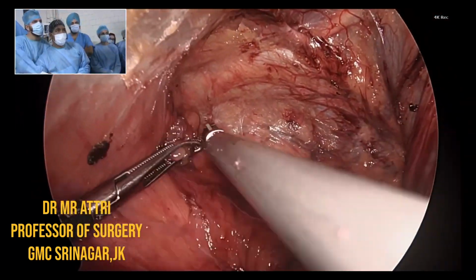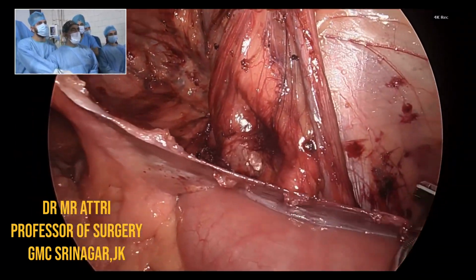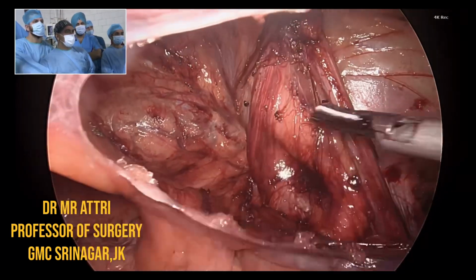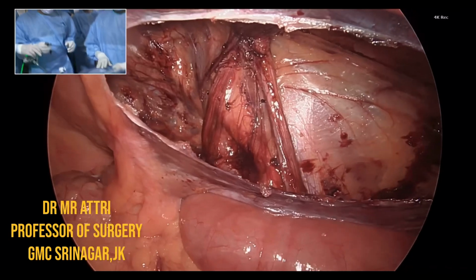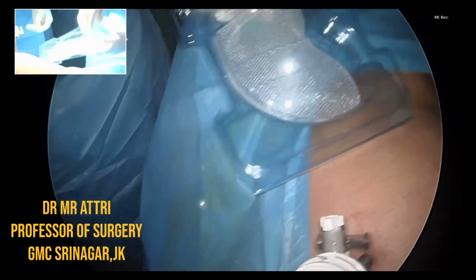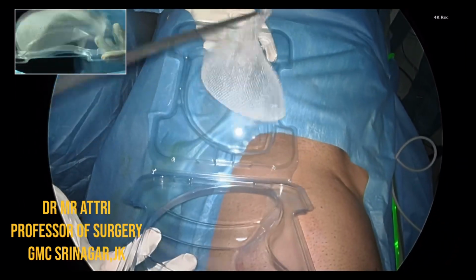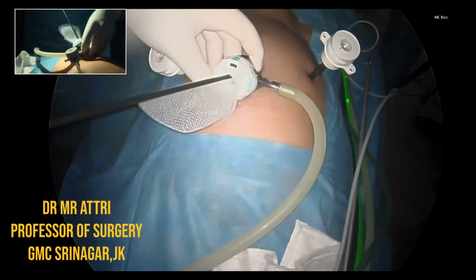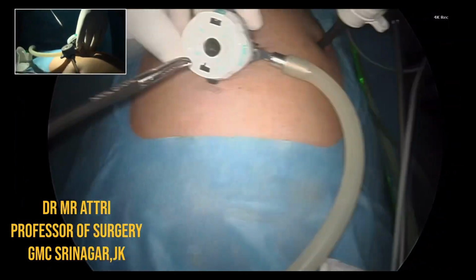Sir, I hope you can see. Is this okay? So this is the midline. I have completed the dissection. So I'll be using the 3D textile mesh from Metronics. Metronics textile mesh. Okay, sir. I'll be using a powered tacker from Merrill. I'll be closing the peritoneal flap with Statafix.